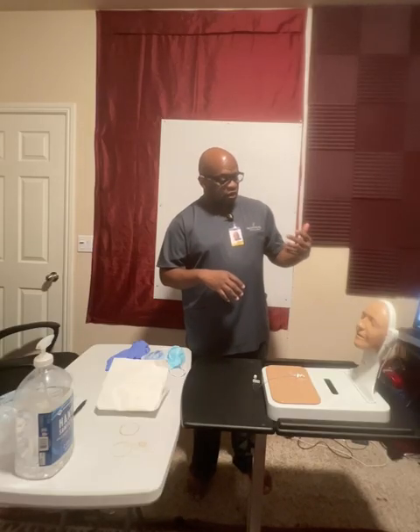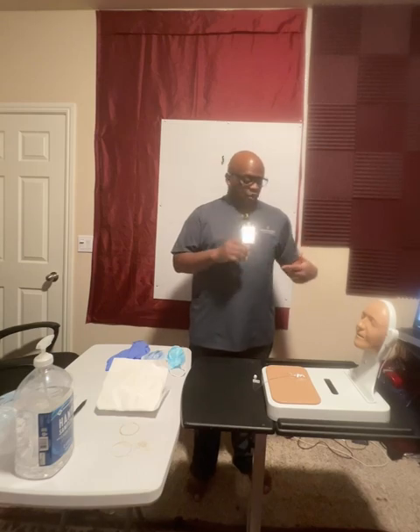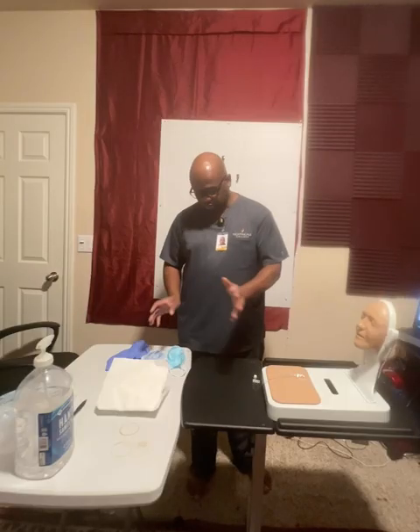And usually in this kind of procedure, you want to make sure that we follow all clean techniques. So normally, either the patient can turn his head to the right or to the left or look away while we're doing this procedure, or we can give the patient a mask. Mr. Jones chose to wear a mask. I thought that was a good idea.